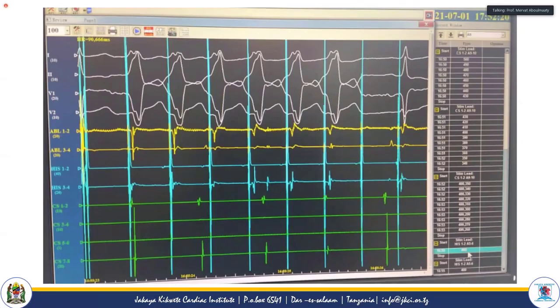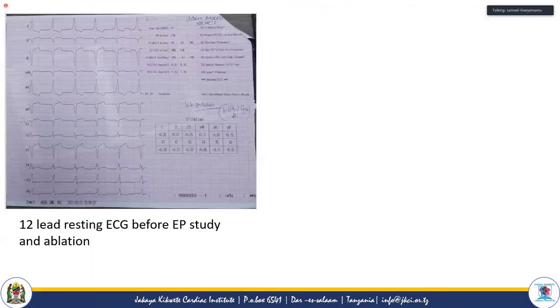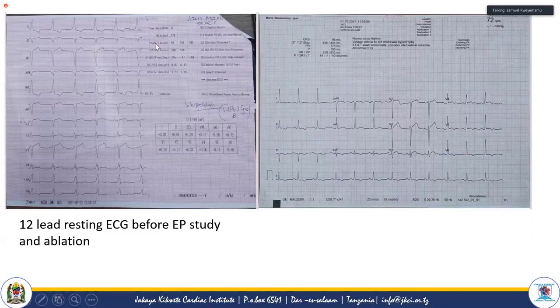Yes, continue, Gandhi. So show us the ECG after ablation. Okay, so after successful ablation, what we did was a programmed stimulation to confirm that this has terminated completely. So we did it with atropine that actually showed the good conduction anterograde and also enhanced retrograde, but no tachycardia was induced this time. So finally, we had these ECGs that are put together. This before ablation, which is fully pre-excited, and you see very normal narrow QRS, ECG with P waves and the QRS, very beautiful, successful ablation.